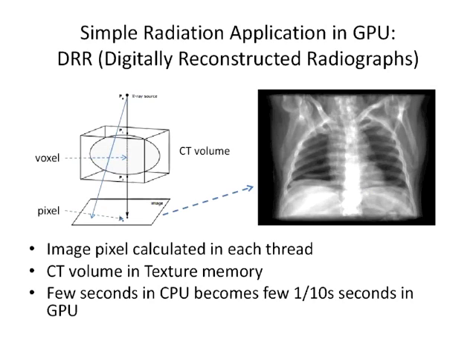If you have a CT volume already, then you can calculate these images just by doing ray tracing, the computer science algorithm. You can calculate the X-ray images or 2D images here. So to shoot many rays is what we call ray tracing.